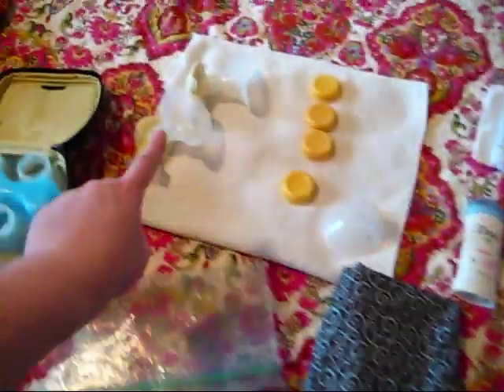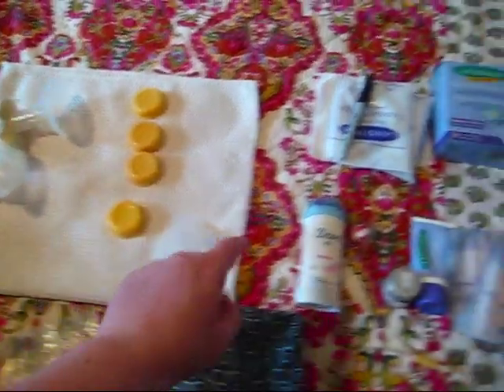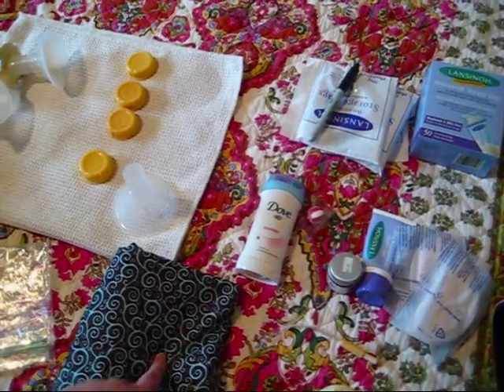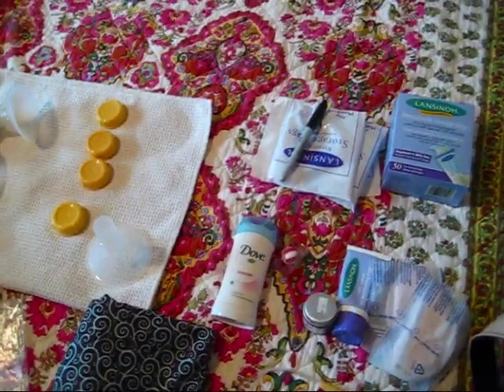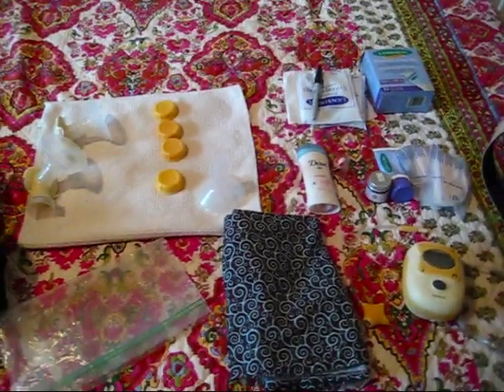That is all that's in my bag — just the pump, the other pump parts, the bottles and ice pack with their lids, something to store the milk in, stuff for my nipples, stuff to cover up with, and I guess stuff in case I stink. Hope that helps, guys. Bye!